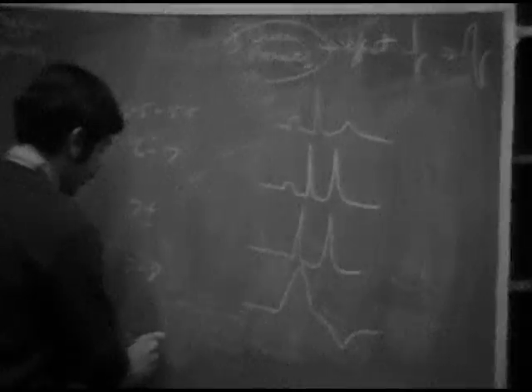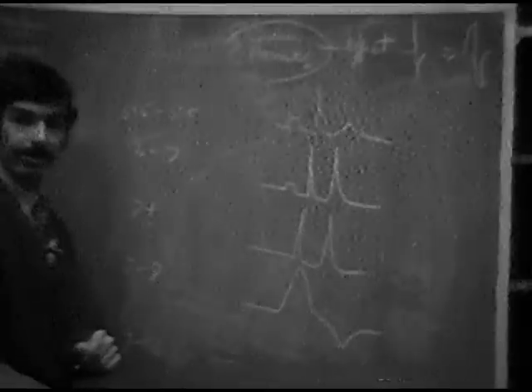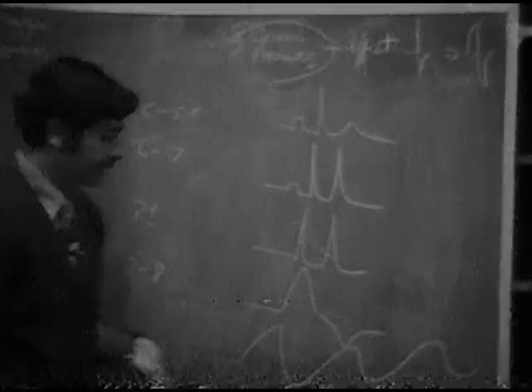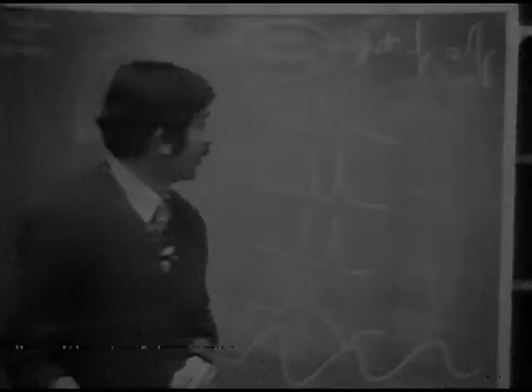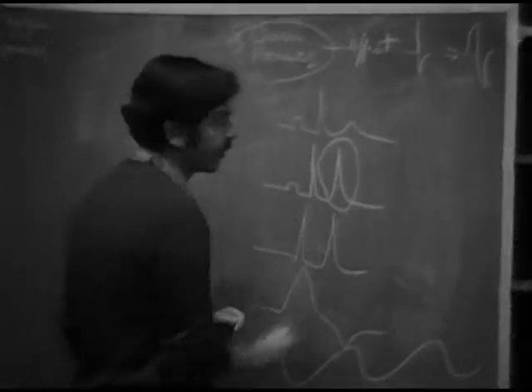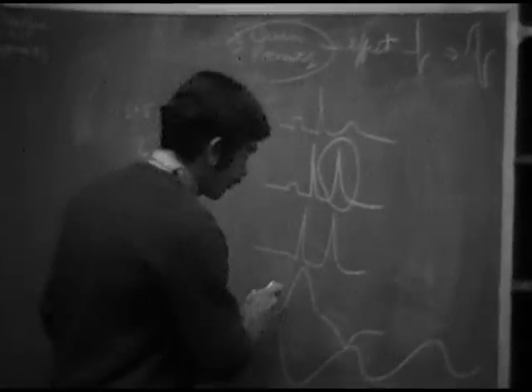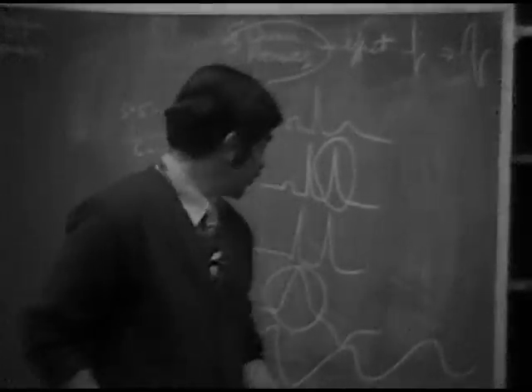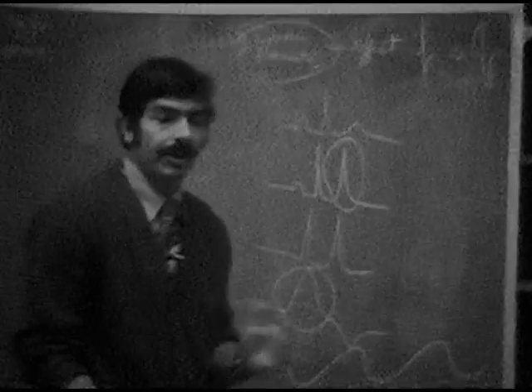Okay, now the important things to recognize. When you get up around 9 to 10, eventually you wind up with an agonal EKG or a sine wave. It just looks like a sine wave, and then they fibrillate. But the most common way that we see patients presenting with hyperkalemia is with T wave peaking, and there are many patients now, at least 3 so far this year, that we've seen that presented looking like complete heart block with an idioventricular rhythm.